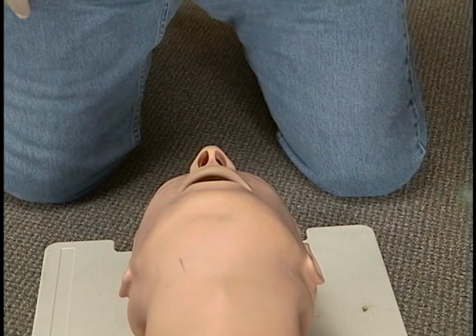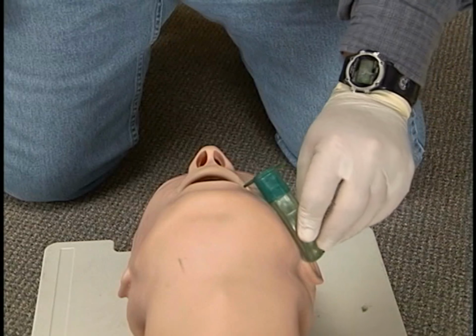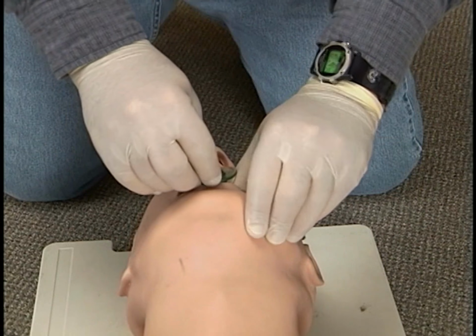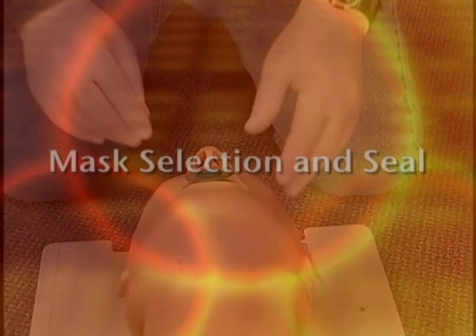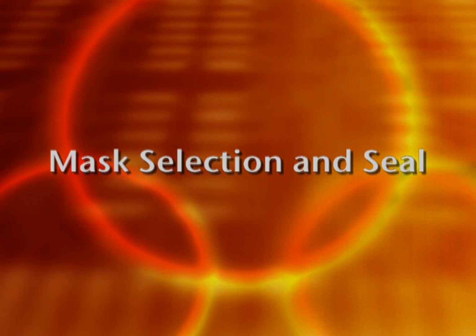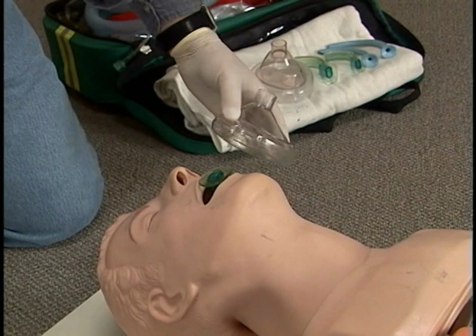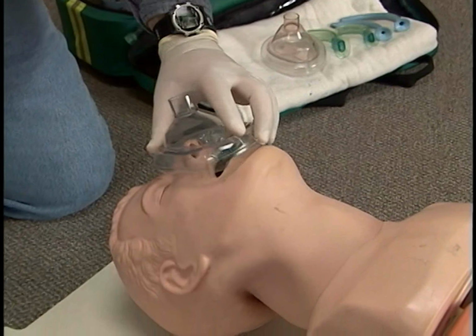Select the appropriate sized airway. This one appears to fit. It is important to select an appropriately sized mask and to create a proper seal on the face of the mannequin. Select the appropriate size mask.